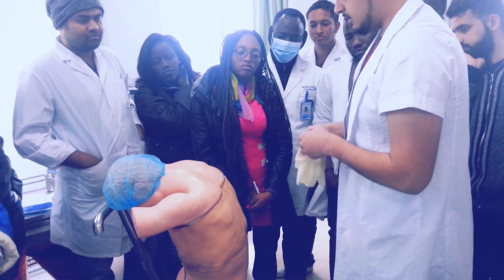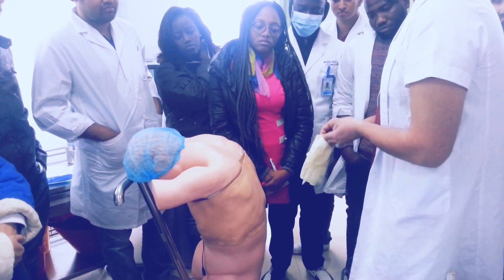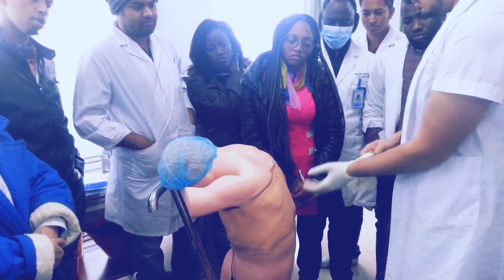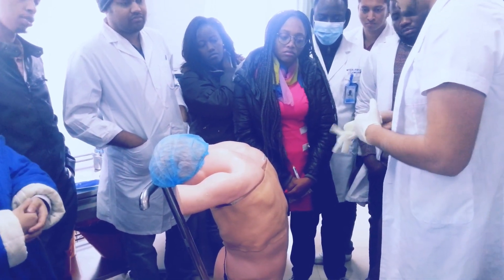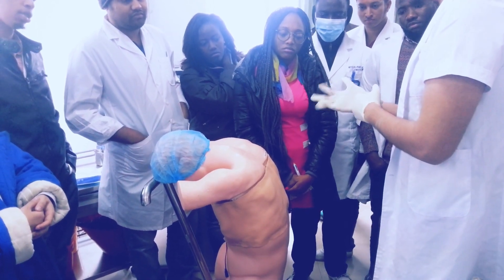I have done this. See — not touching the outer side; the disinfected side stays disinfected.